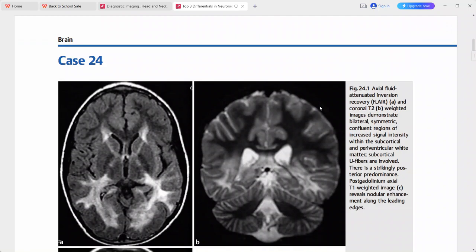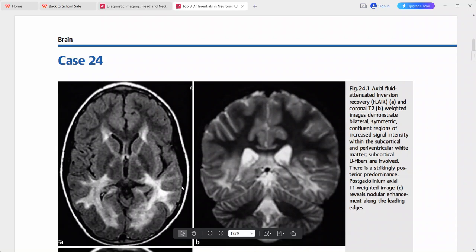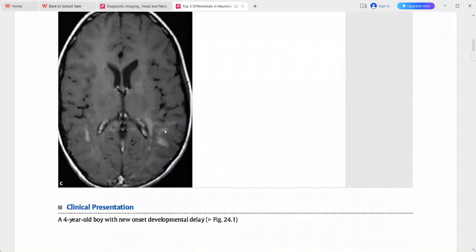Next, a four-year-old boy presenting with new-onset developmental delay. Axial FLAIR and coronal sequences show bilateral symmetric confluent regions of increased signal intensity within the subcortical and periventricular white matter. The subcortical U-fibers are involved, with a strikingly posterior predominance. Post-contrast axial T1-weighted MRI shows nodular enhancement along the leading edges of the lesions. This imaging picture is typical for adrenoleukodystrophy.